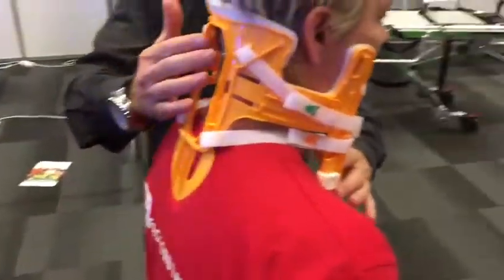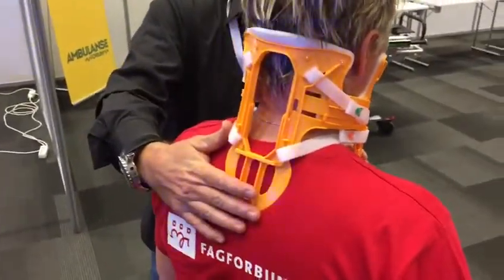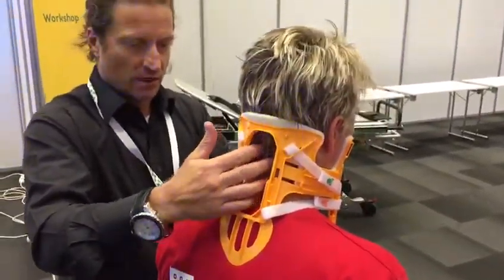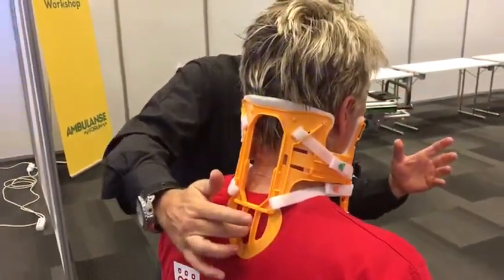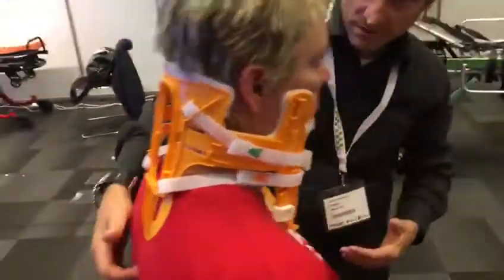When the patient is delivered to the emergency room, the doctor can feel C1, C2, and ask the patient about any tenderness — so there's no need to take the device off. You can feel all the way down, non-stop. It's full access for doctors or nurses in the emergency room.